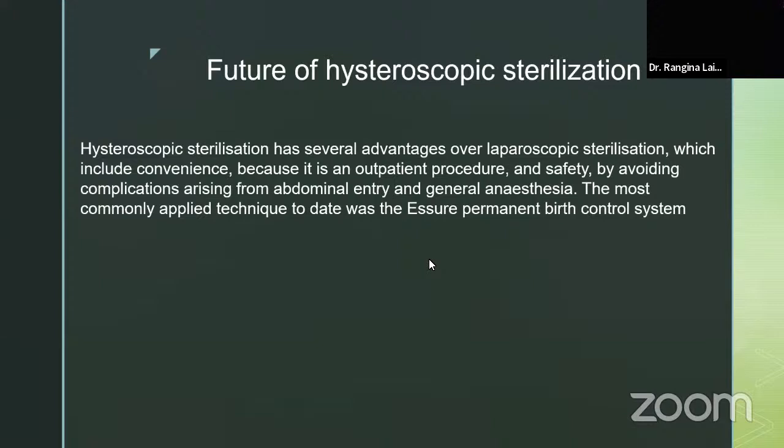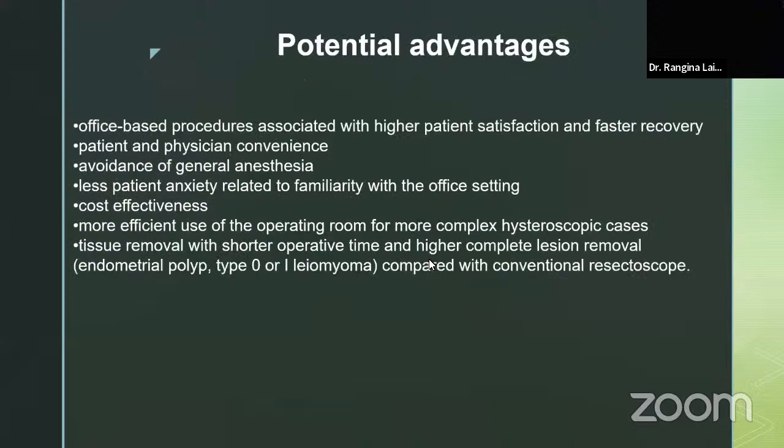And yes, of course, the future of hysteroscopic sterilization. We have been hearing at several of our conferences that it has several advantages over laparoscopic sterilization, which include convenience. It is an outpatient procedure. Safety, by avoiding the complications arising from abdominal entry, and of course, general anesthesia. We all know that most of our hysteroscopic procedures are done under short anesthesia, and the most commonly applied technique to date is the Essure permanent birth control system.